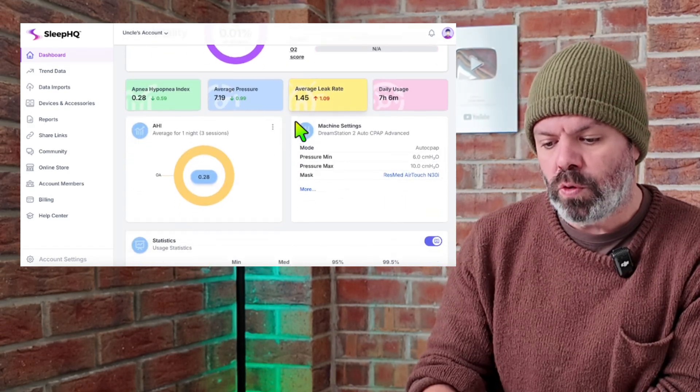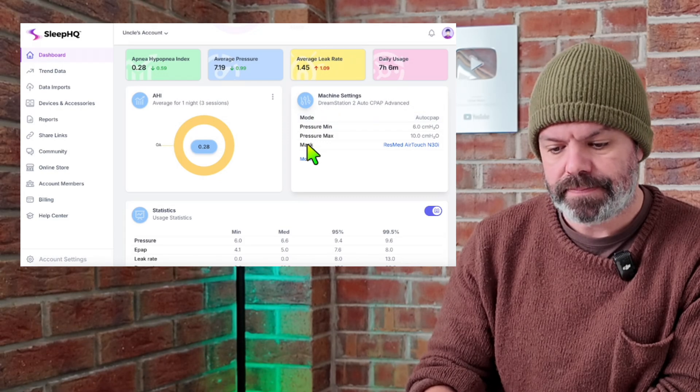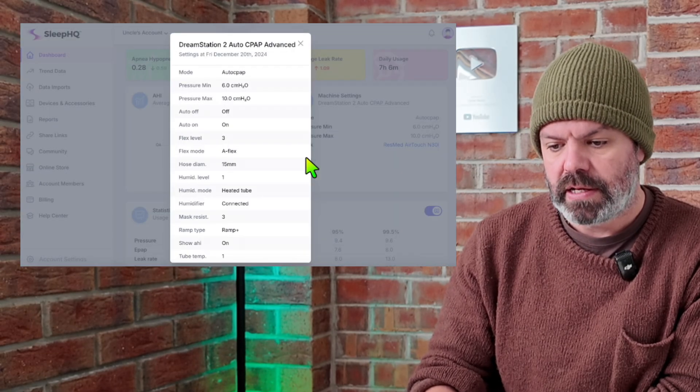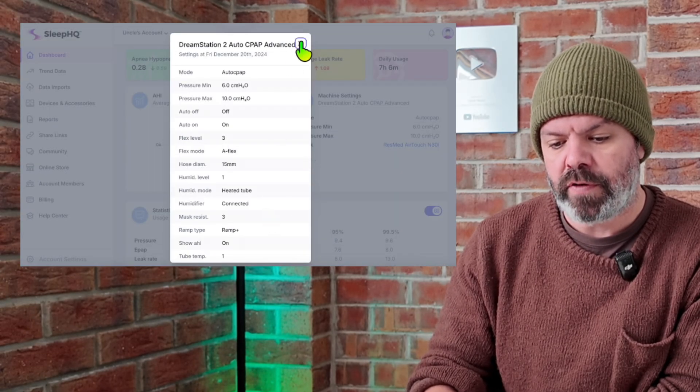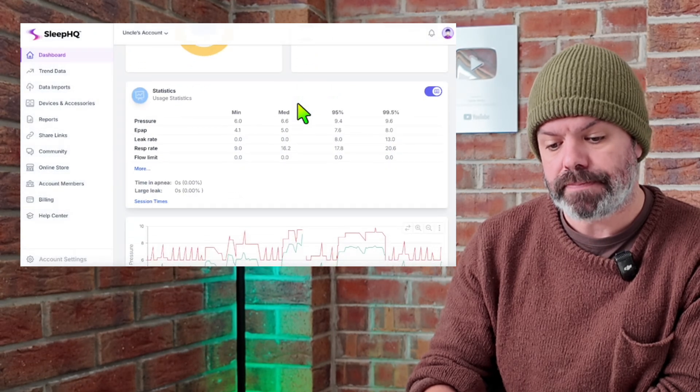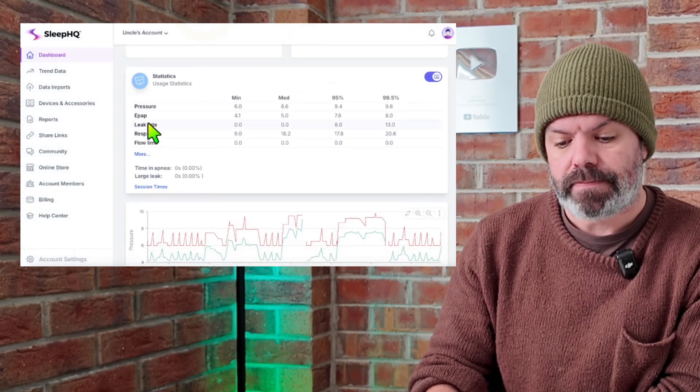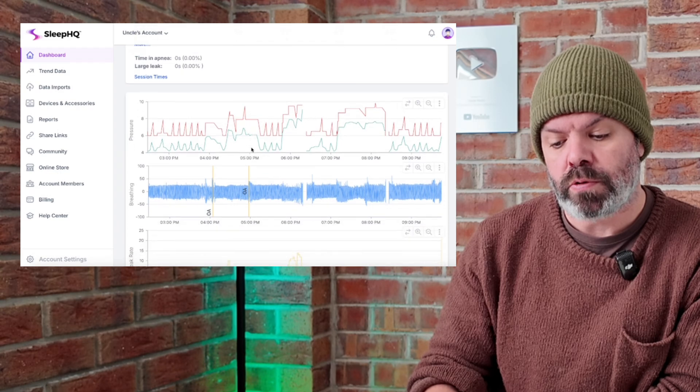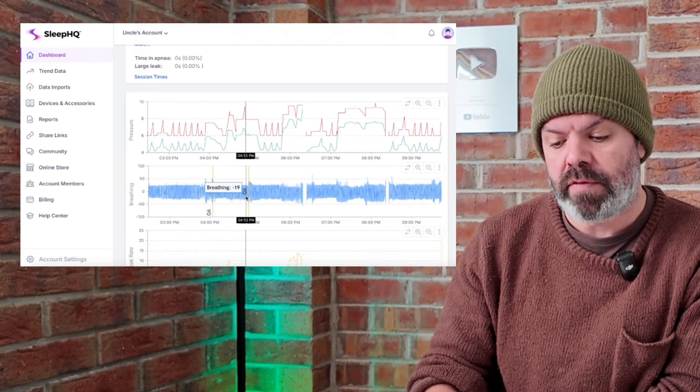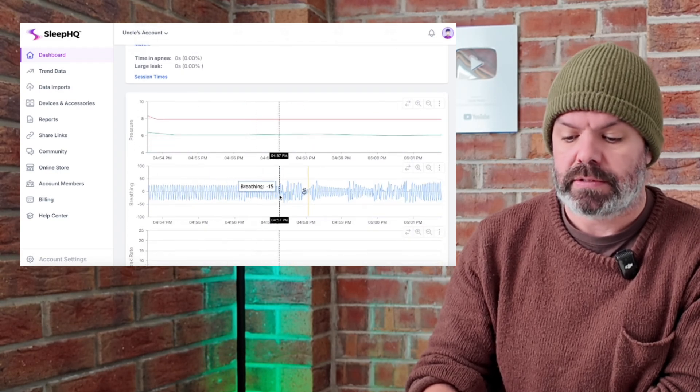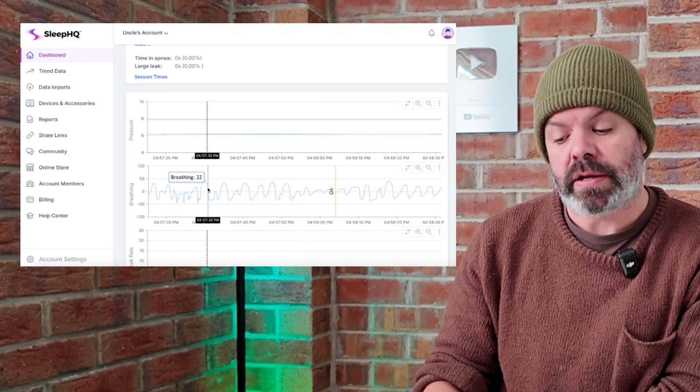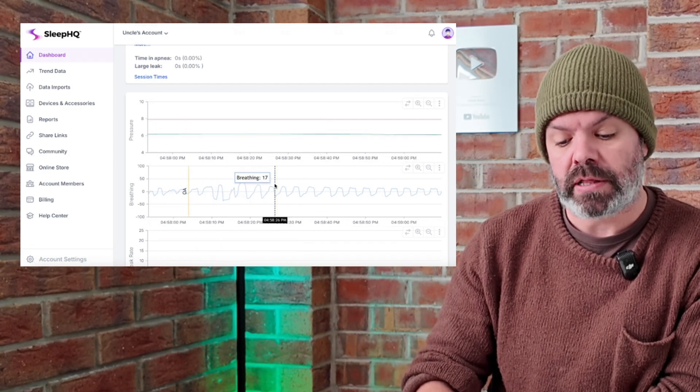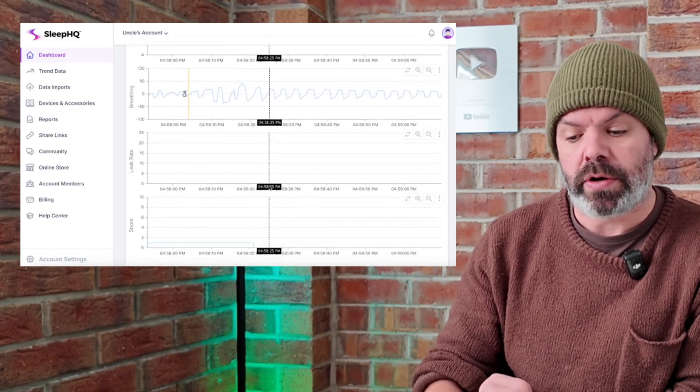We can see we have all the device settings here. There's all the device settings. And if we scroll down a little bit further, we've got all the statistics. We've got our pressure trace and we can also zoom in and see every single breath that was taken throughout the night in high resolution. You've got your leak rates there, your snoring and so on.